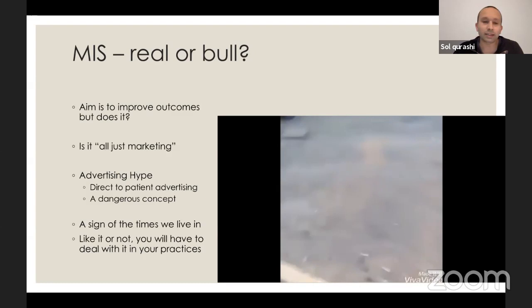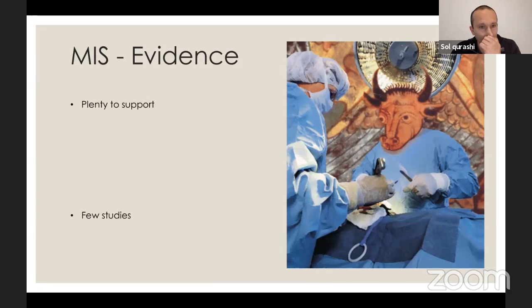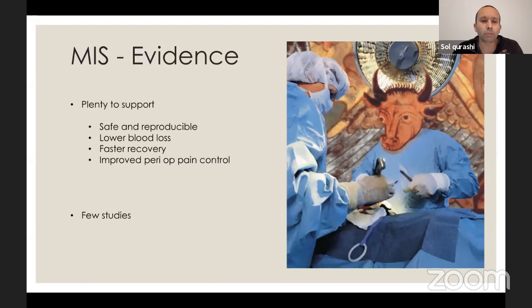When you actually look at the evidence, and I'm not going to talk about anterior too much, but when you look at the evidence for minimally invasive surgery, particularly posterior, there's plenty of evidence now to show that it's safe and reproducible in the right hands. And I think that's the key phrase, as long as it's done well. There are studies showing a lower blood loss, faster functional recovery, improved perioperative pain control, shorter length of stay, et cetera. And if you want to dissect those studies, there are some good studies, some pretty average studies, some pretty poor studies.